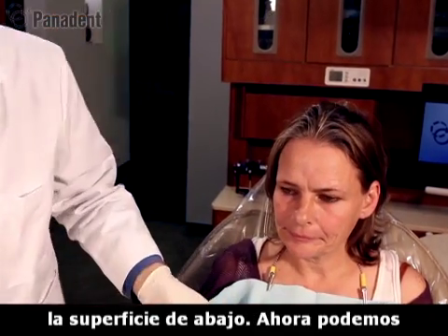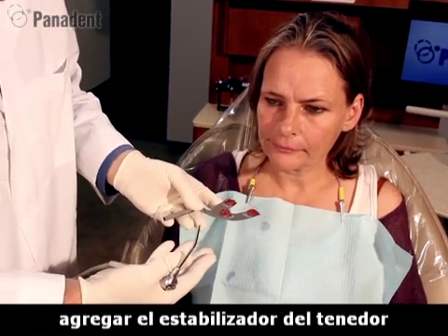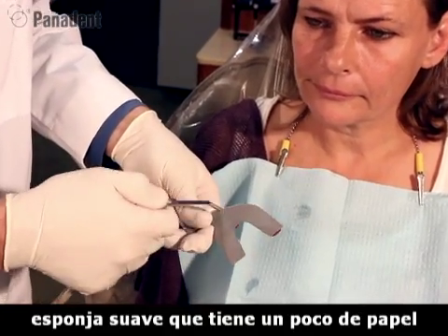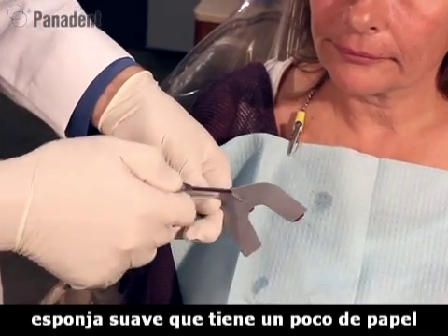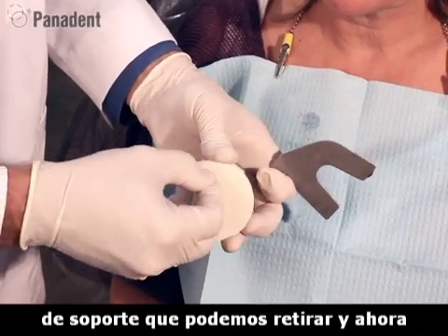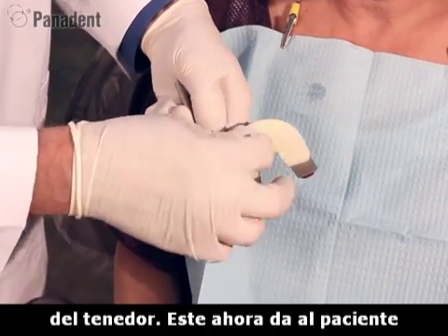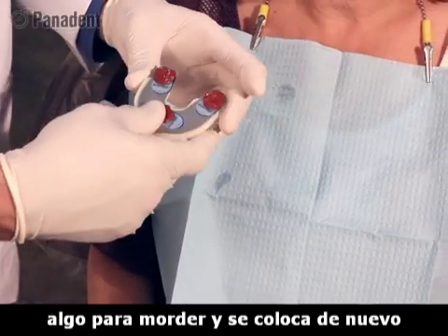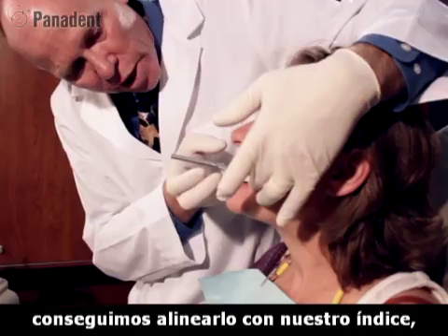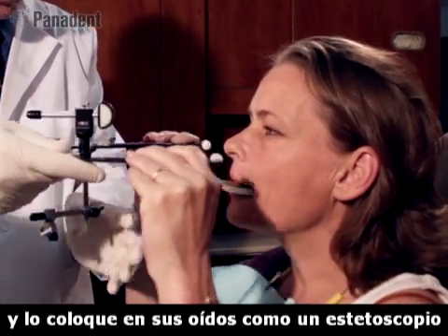Now we dry the lower surface. We also developed a new product called the Bite Fork Stabilizer — basically a soft sponge material with a paper backing that we can peel off. We stick this onto the bottom of the bite fork, which gives something for the patient to bite into when we place it back in the mouth. We go back in the mouth, get lined up where we had our index, and bite up. Then we come in with the face bow and have the patient reach up and put it in their ears like a stethoscope.